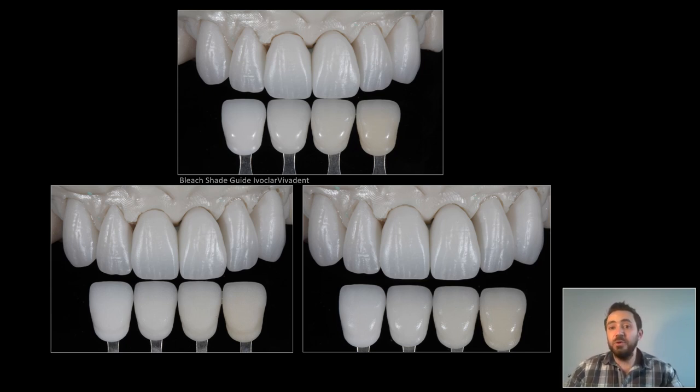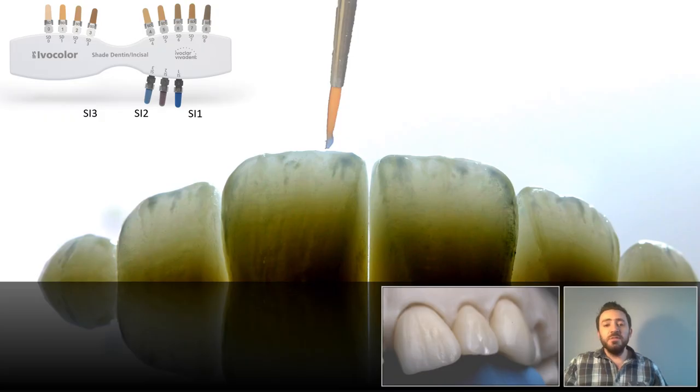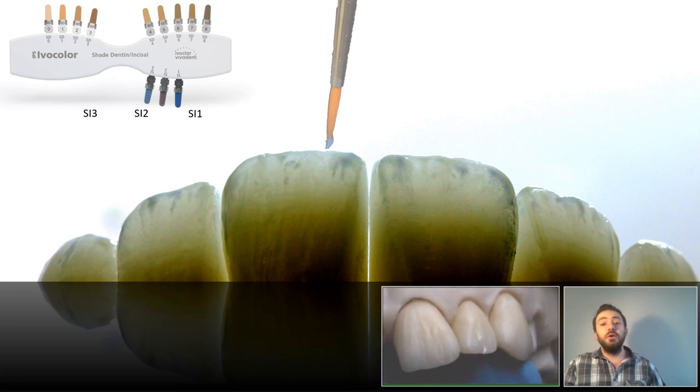That indicates that no stains are needed to correct the shade — I could easily glaze those crowns and finish the case. However, here I chose to create further useful opalescence and more lifelike structure, so I proceeded with further characterization.